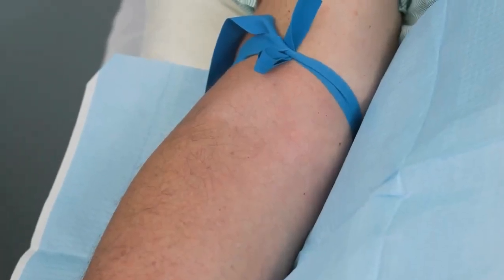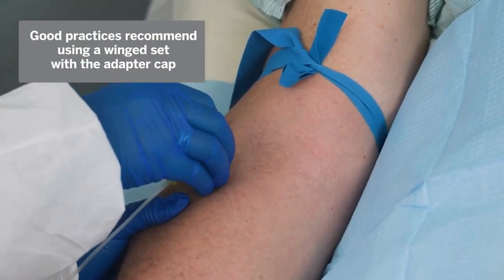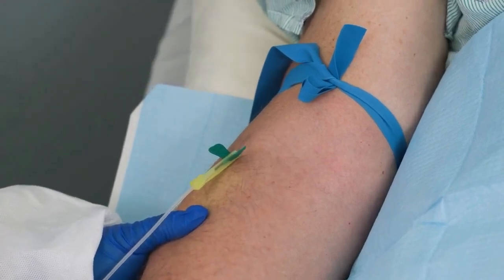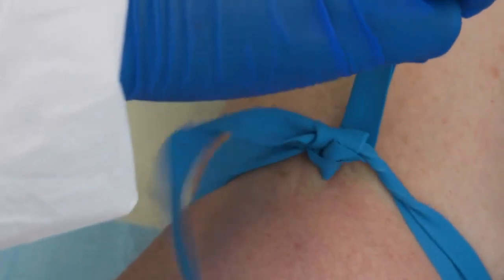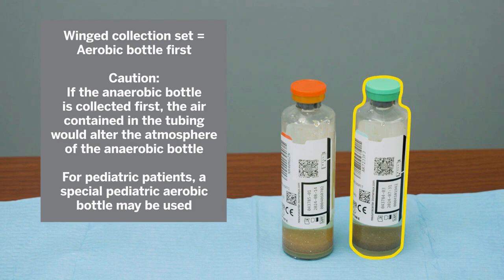Do not repalpate the prepared vein before inserting the needle. Enter the vein swiftly. Blood appearing in the blood collection tubing confirms a successful venipuncture. Release the tourniquet as soon as the blood starts to flow, and always if it has been in place for two minutes or more. Always start with the aerobic bottles first, as the air contained in the tubing will not affect the atmosphere of the aerobic bottle. If the anaerobic bottle is collected first, the air contained in the tubing will alter the atmosphere of the anaerobic bottle.